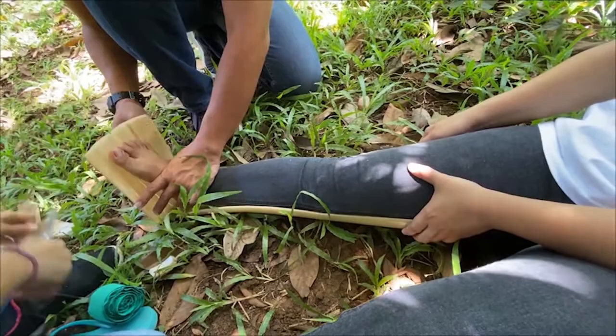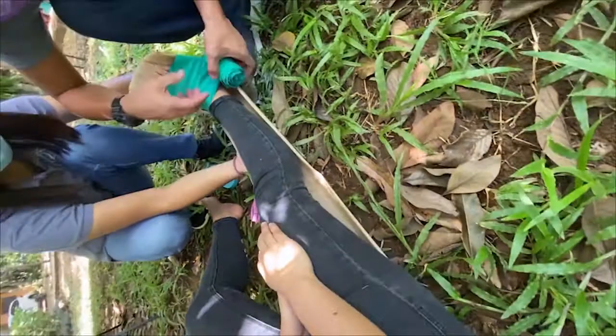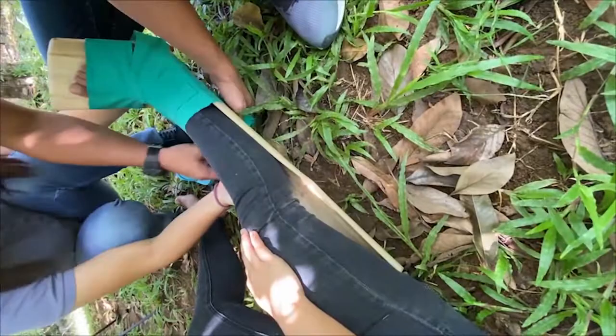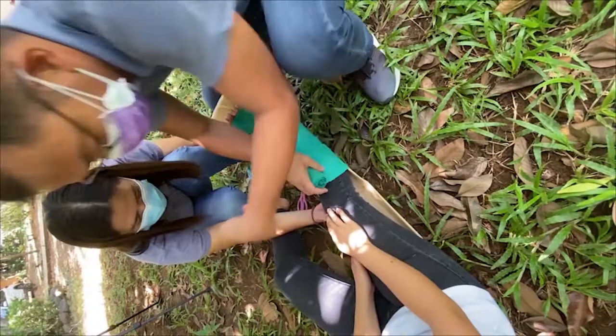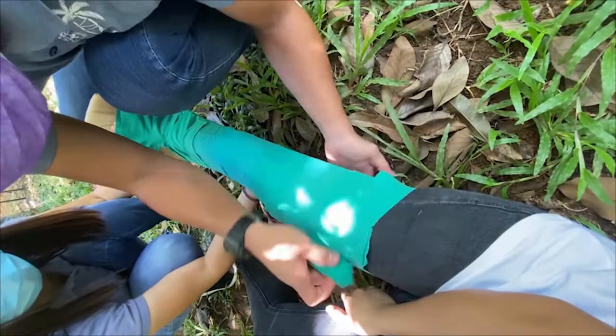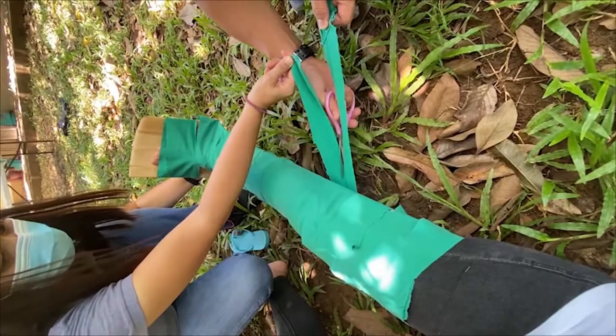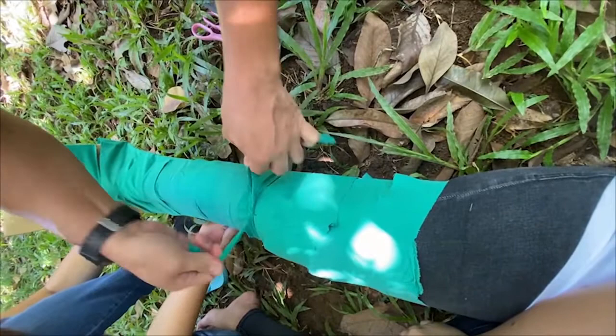Place the injured leg in a straight position with applied gentle traction to avoid bending of the fractured area. The splint should be longer than the foot and above the knee. You may place additional support on the sides of the leg. Mold the banana stalk near the ankle according to the size of the foot. Start rolling the bandage from distal to proximal position with enough tension to hold the splint. Too much tension can cause swelling and too loose cannot hold the splint properly. Make sure to expose the toes of the foot to assess blood circulation. If the bandage is too tight or there is an existing vascular injury, it will become cyanotic or pale. Cut the end of the rolled cloth into half and tie it securely.